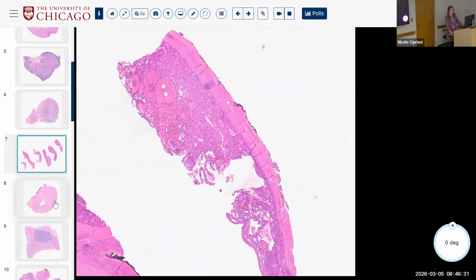Would there be good staining on these fresh specimens? Yeah, it works okay. You may get better fixation at the edge. So if it's negative or weak in the unfixed portions, always be mindful of that. But if you have good staining in the fixed edges, then you should be fine. If the BRAF mutation is absent, you would think otherwise.